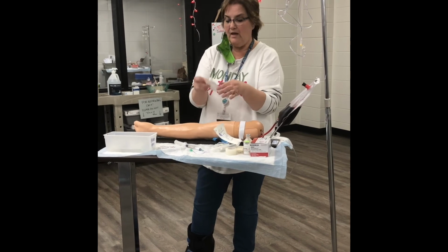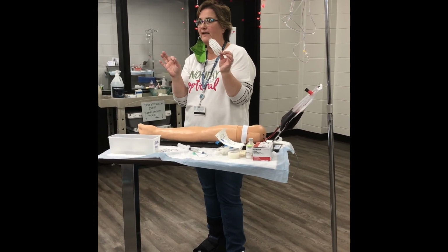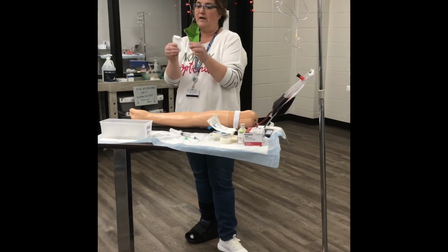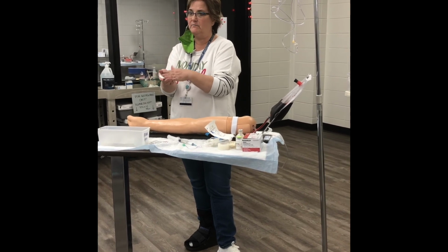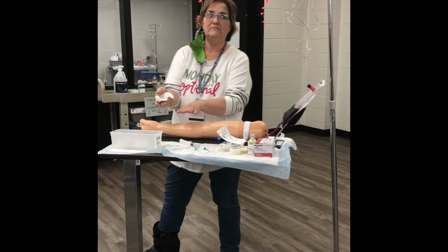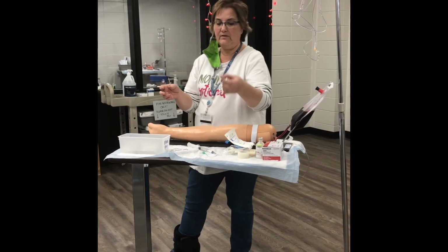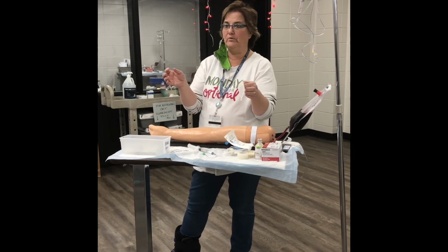Oh, the other thing, transparent dressing. Again, you're only going to have one hand because you can't let it go until you get the dressing on it. So fold that down. I did not peel it apart and expose any of this. This has got to be sterile when it goes down on my site. Just bend it like that, that way you have a little handle to pick it up, and it's easier to pull apart.